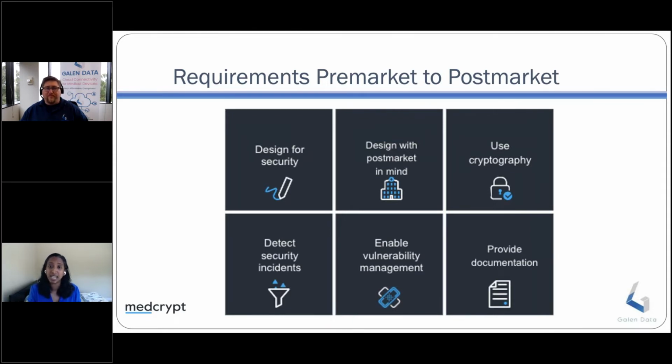But the reality is, for this to actually be effective, if you don't have collaboration between the producer of a device, the device maker, the consumer of the device, and the patient using the device, you're really struggling to have a cybersecurity strategy that's going to hold over the lifetime of this thing. Frequently, device sellers will get their device into a hospital and then say, it's out of our hands, it's on the hospital's network, that's on them to maintain. And the device regulator has basically come back and said, that's no longer a viable strategy.